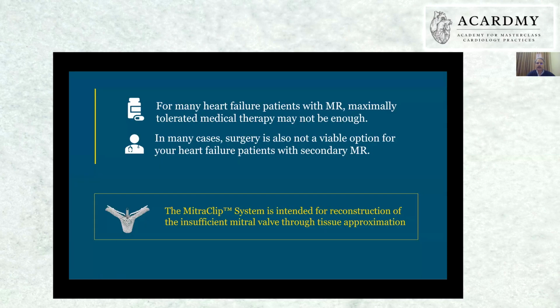For many heart failure patients with MR, maximally tolerated medical therapy may not be enough. And this was very evident with my last case, which I'll take you through. We see many patients who are deteriorating in heart failure because of the MR status despite GDMT.